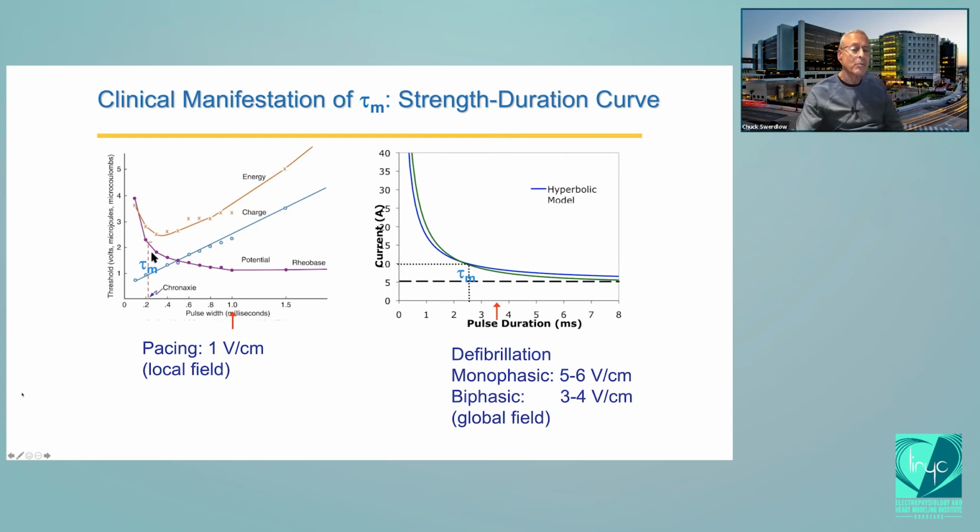And you learn that was important because that's the shock strength that defibrillates with minimum energy. Another way to say that, that's the pacing pulse that captures with minimum energy. Exactly the same thing is true for defibrillation.